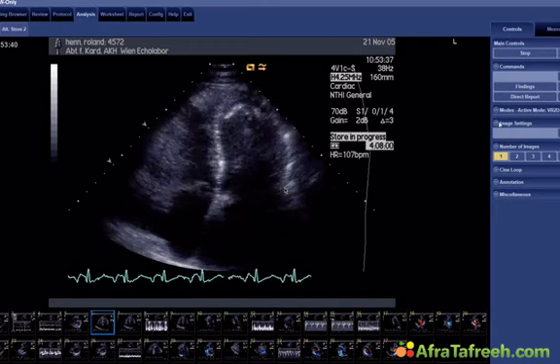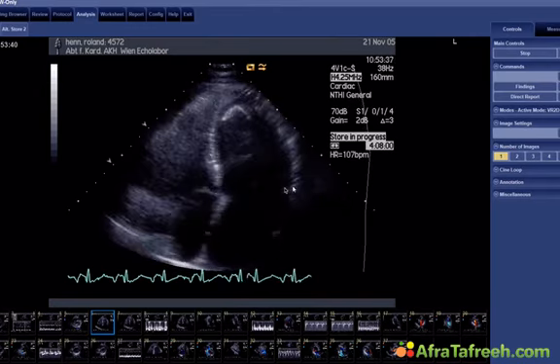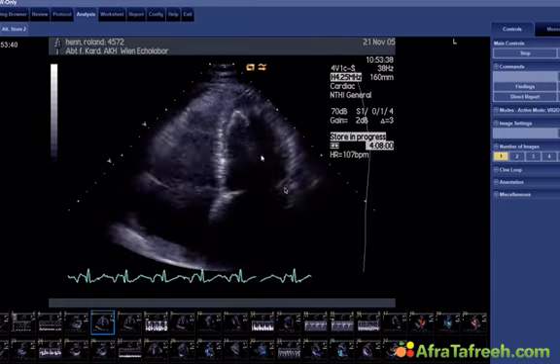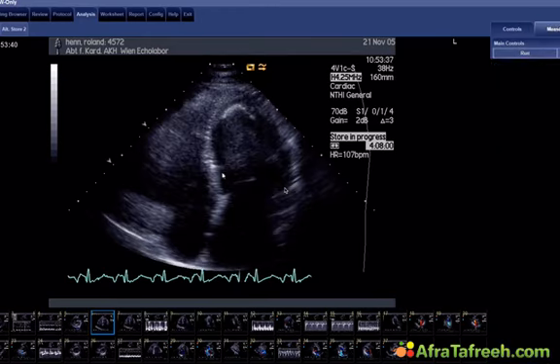This is now the 4-chamber view, and some of you will now say aha because you might already know what the diagnosis is. The image quality is not very good, but one thing which is quite clear is that the left ventricle is really hypercontractile. So if we measure the size of the left ventricle, let me just go through this. This is end diastole.